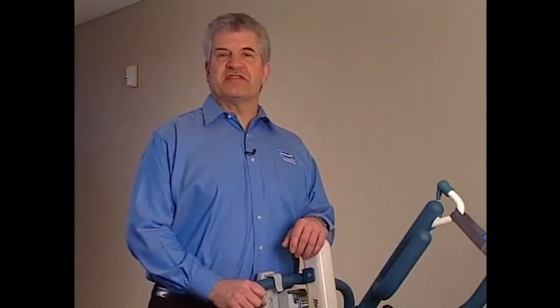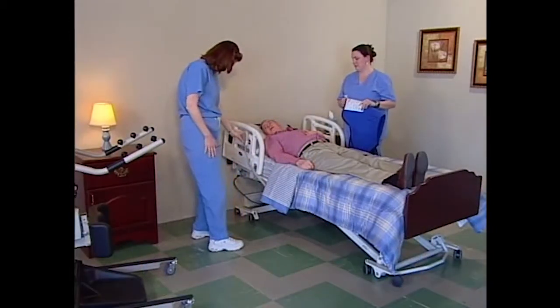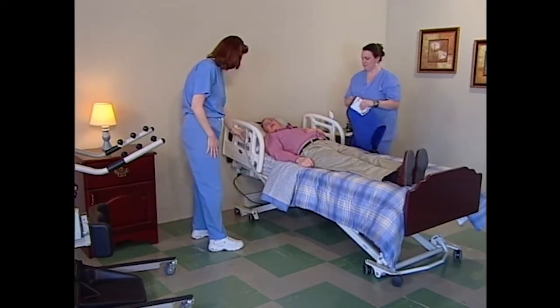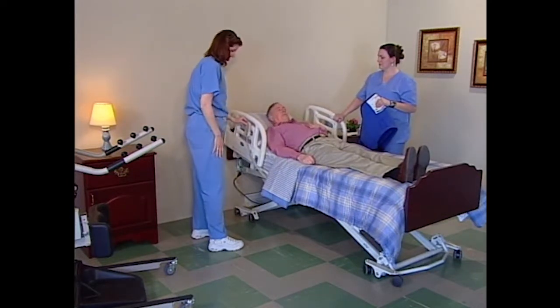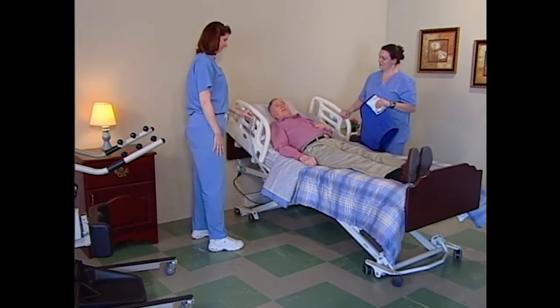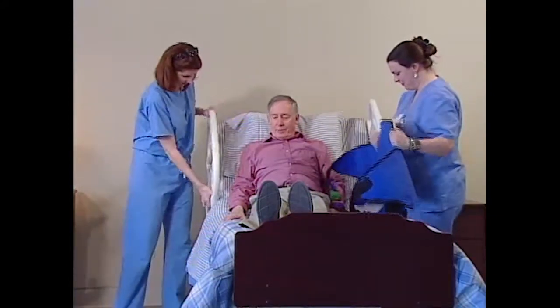Watch as we position a standing sling for a resident transfer. Before performing the lift, make sure that the bed is at a safe working height for the caregiver. Next, get the resident in a seated position on the edge of the bed. Use the head section of the bed to raise the resident to a seated position.